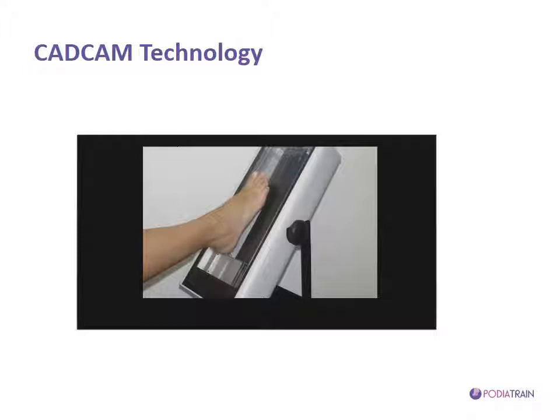So we will not need vacuum formers anymore, we'll not need plaster of Paris. We can work virtually any time of the day without disturbing anyone when we are designing our object or our insole in this case. An important advantage is the accuracy.